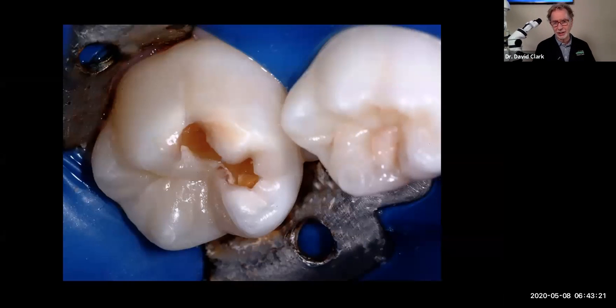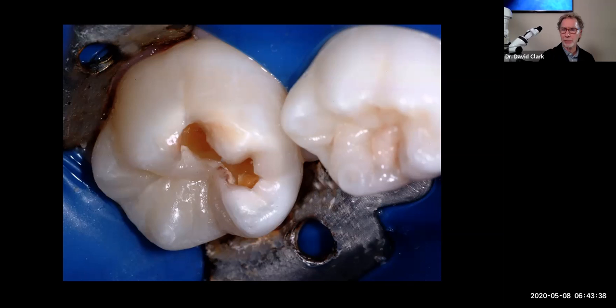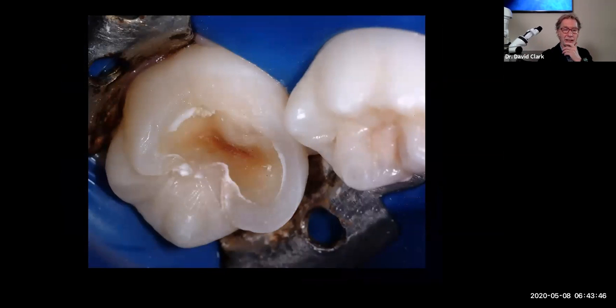So I'm going to show you a case that I treated back in the dark days, right? So here we are, and sunlight's coming through. Look, I'm getting beautiful shadowing here, okay? This is a young patient. She is 6 years old, I believe, at the time. And this is what we see oftentimes. And Dr. Solomon's nodding his head, like, oh boy, here we go, right? Patient's asymptomatic.